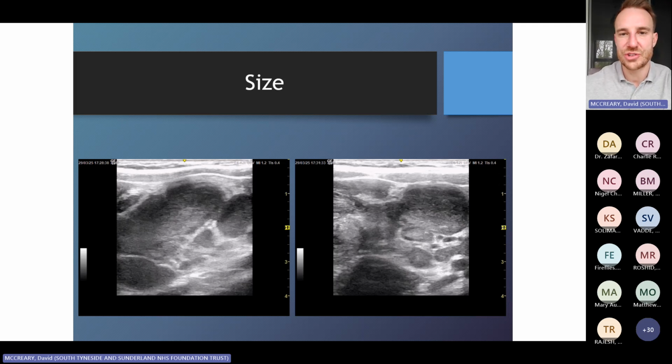This was another child who was transferred to the tertiary centre after we did this scan just because of their age. There were only 3, but they did turn out to be nothing more and got discharged 2 days later after a radiology scan confirmed the exact same findings and felt that it was mesenteric adenitis.